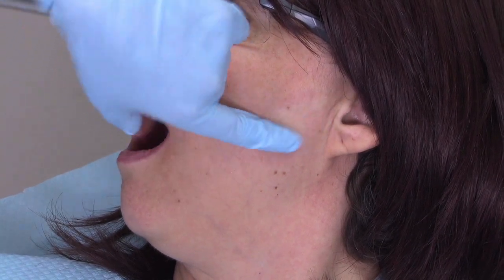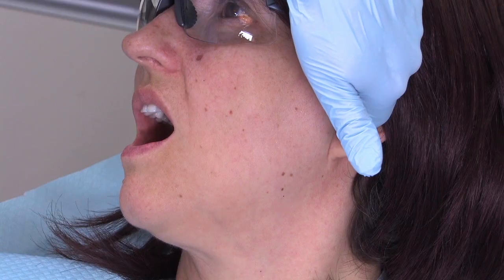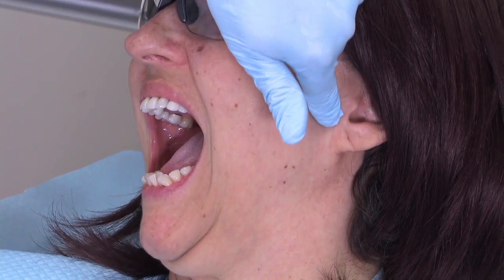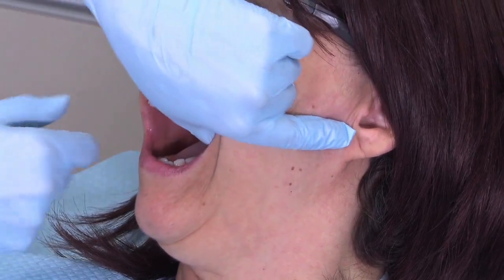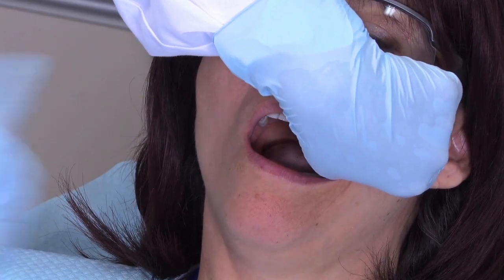I seem to recall that people actually put their finger in the patient's ear to do it. Is that not really necessary? I'm sure it's not comfortable for the patient. I can appreciate that it might help them have a sense of where the condyle is, same as when you're doing a TMJ check. But with my finger there as she opens wide, you can feel the articulation — you can feel it move. So I know it's about here.